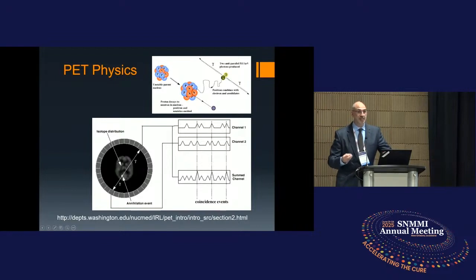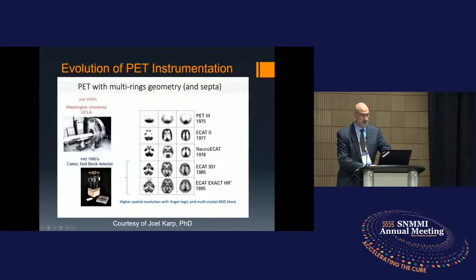A positron is actually the opposite of an electron. It is a positively charged electron. Almost exactly where that positron was, it immediately disintegrates into two photons that go in opposite directions. And that allows our PET technology to detect it. And this is just a two-dimensional representation of the brain, but we put them together and we make a three-dimensional representation of the brain.